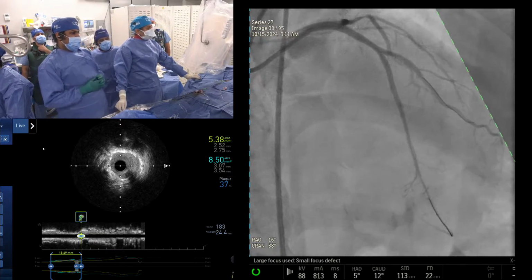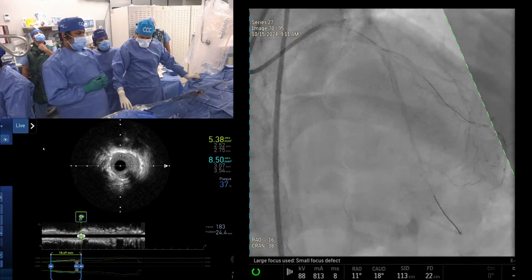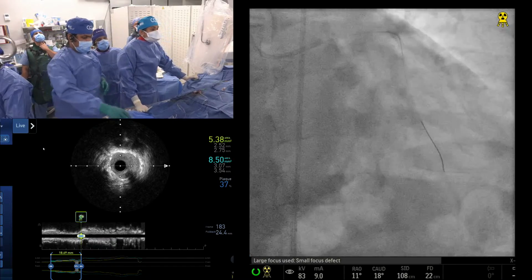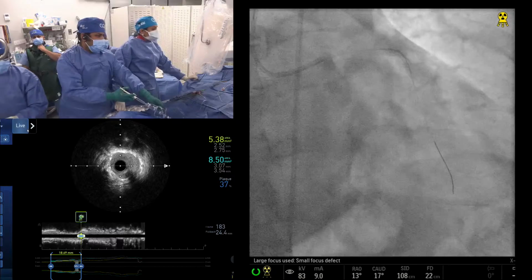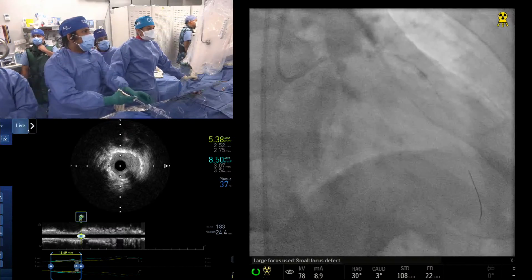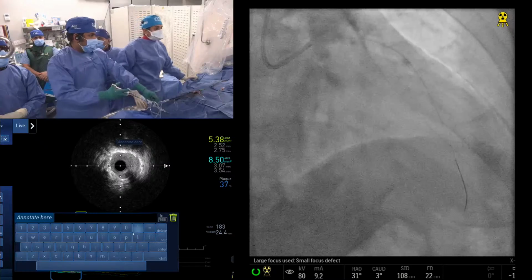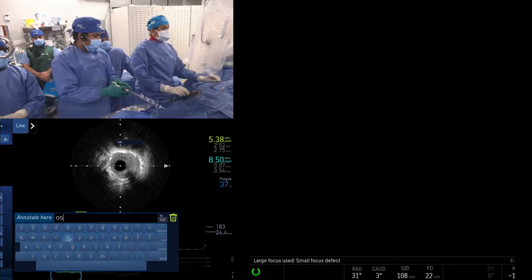I mean, because he's a young guy. Once upon a time when nothing existed, this used to be left alone. So let's take a good picture. Your feeling is that Tandem Heart is out of favor, and what is coming in is ECMO? Exactly. That is correct.